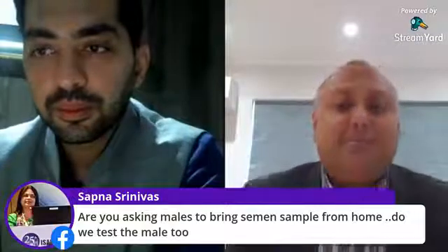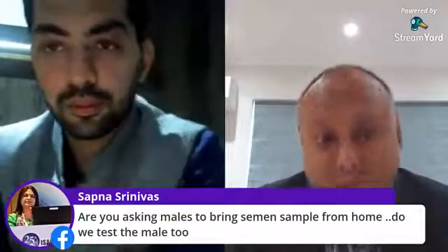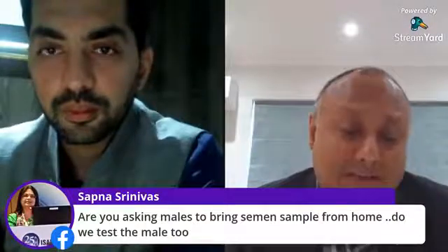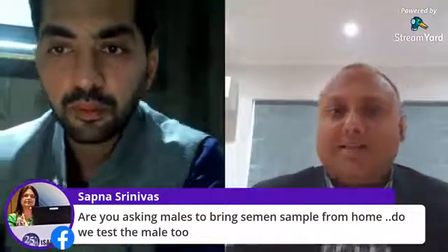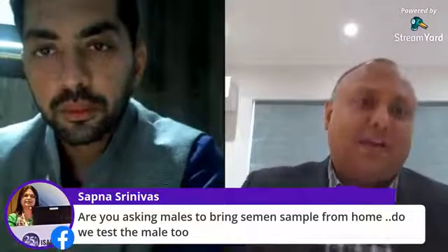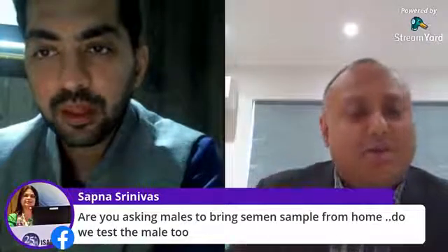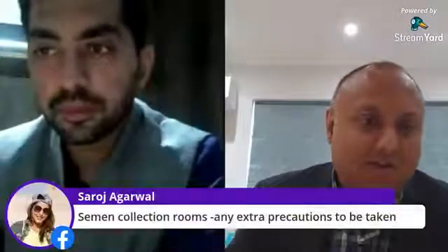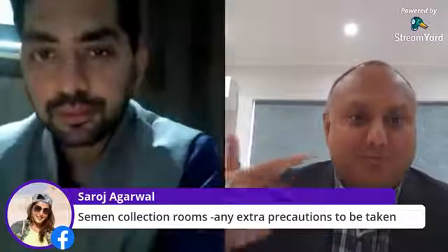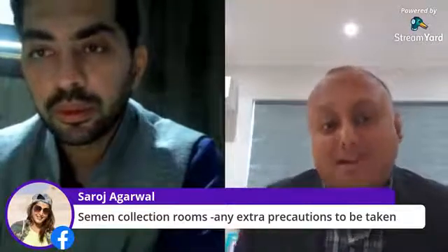The question about freezing the samples: we haven't really taken the approach that we will only use frozen samples. What we're encouraging our patients to do is to produce the semen sample at home and to have a non-contact approach of delivering the sample to us, as they call it in the US, the curbside, the roadside sample assessment. So we will get all of our patients to do their sample at home, bring it with them, and then the lab will process it from then on. Also we're trying to minimize the use of the same room between patients. Of course, you could have decontamination and everything going on, but that still puts your staff at risk. It puts the multiple patients who are going to be entering that room to do a sample at risk as well. So we've taken an approach that samples have to be done at home.